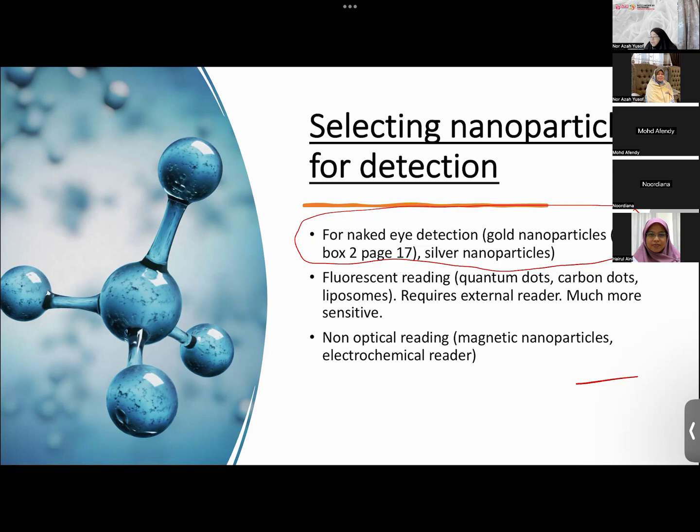So I think just now Effendi was asking about how much. So this is a very detailed process, okay, no, this one, not referring to the other one, your question will be in the other box. But this one is a procedure that you can use, page 17, box 2, how to prepare the conjugated nanoparticles. Okay, how to anchor the nanoparticles to the antibodies. So you can choose to have this, or, probably for those who haven't tried yet, you can choose to try our protocols.